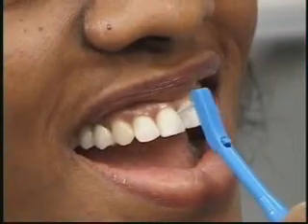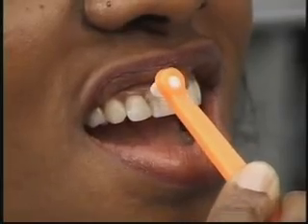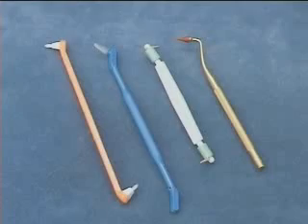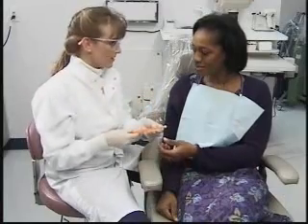Special tools are necessary to reach down beyond the normal three millimeters to thoroughly clean the indentions in the sides of the roots in a pocket. Each tool is useful in different areas of your mouth. We'll be happy to work with you to custom tailor a plaque removal program using these special tools and techniques.